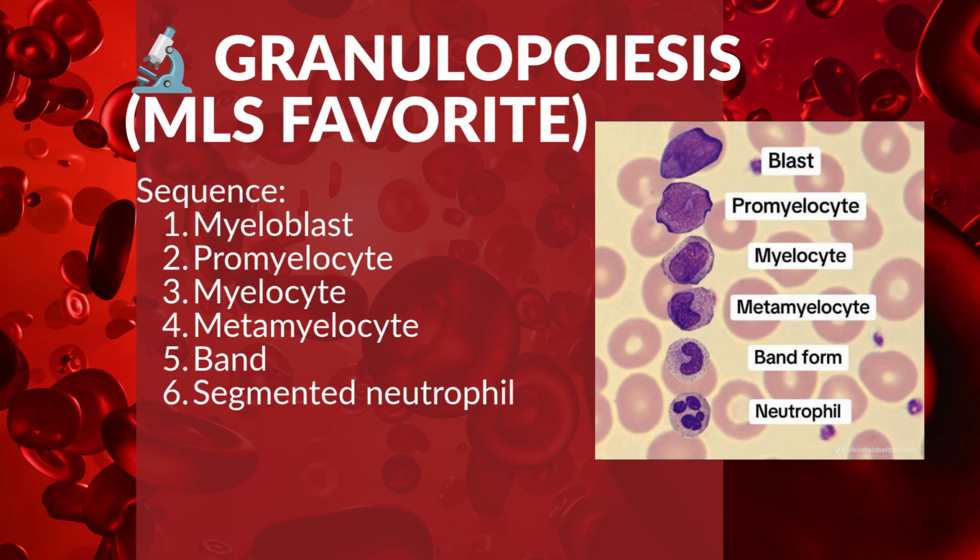That's the neutrophil. We got 2 to 5 lobes. We got clumped chromatin, and we are fully functional. The major job for a neutrophil is bacterial defense. Segments are the final soldiers. Granulocytes are mature: the nucleus condenses, chromatin clumps, nucleoli disappear, and the cell becomes more specialized.